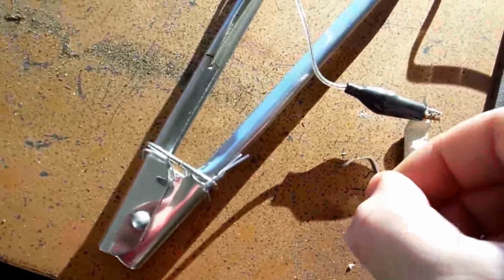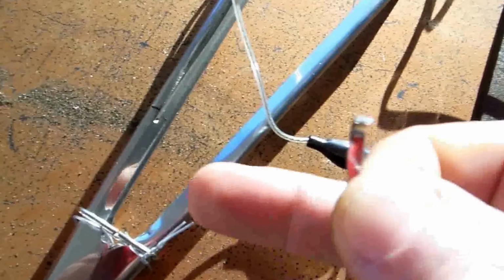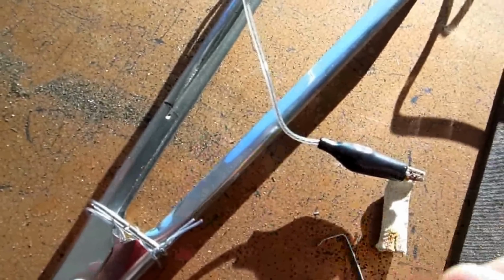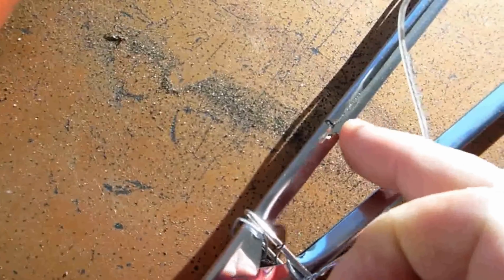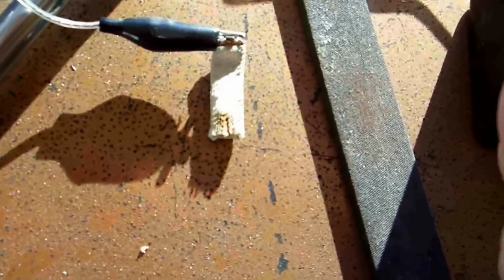So that's how you can make these metal strips. And if you lose them or whatever, that's how you can make them. I used just the regular tongs. This is out of Walmart, 97 cents. You can actually still use the tongs too. There's nothing wrong with them. I just cut a little piece of metal out of it, and I used a file to go over the edge. So like this, the edge on here isn't sharp, burred or anything.